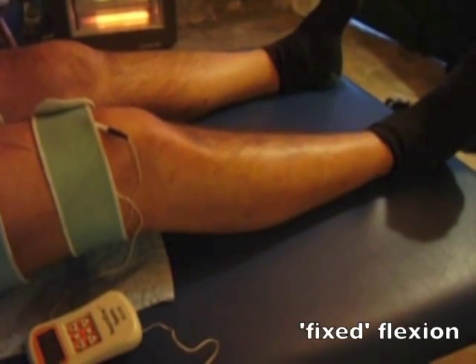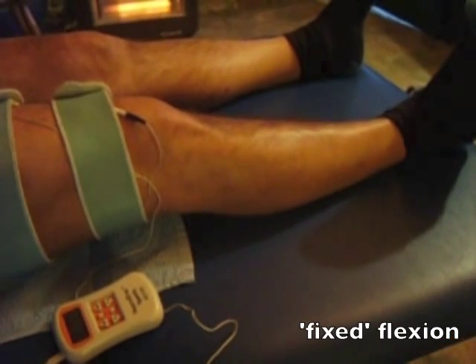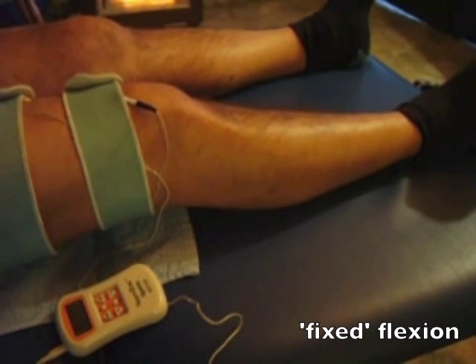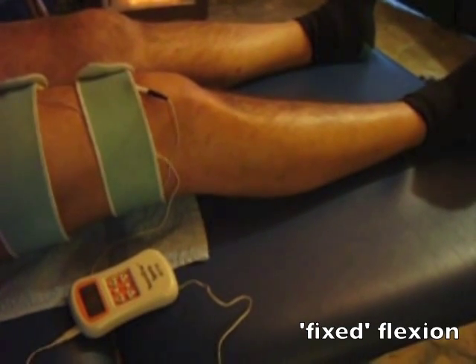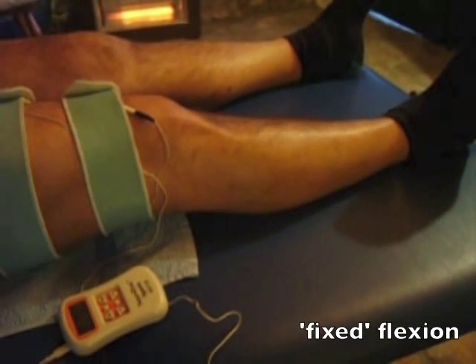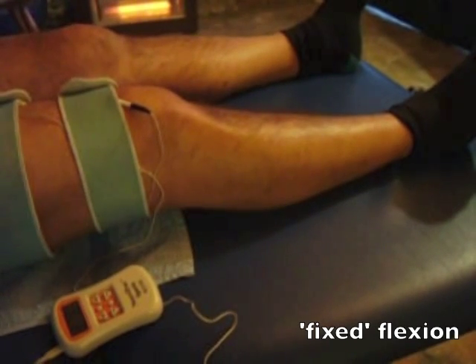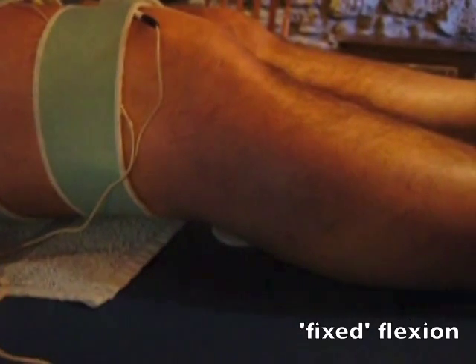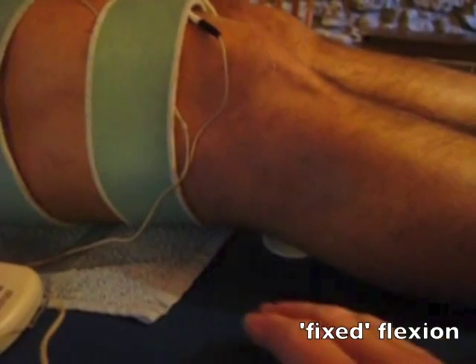In some cases the knee cannot be straightened fully comfortably. This can happen following injury or in certain types of arthritis. In this case it's best to support the knee with a folded towel or a small roll. The knee support should be soft so that as the VMO comes into action the knee is allowed to straighten comfortably within its limits. Over time, with the work on the VMO, the knee should be able to straighten better than at the beginning.